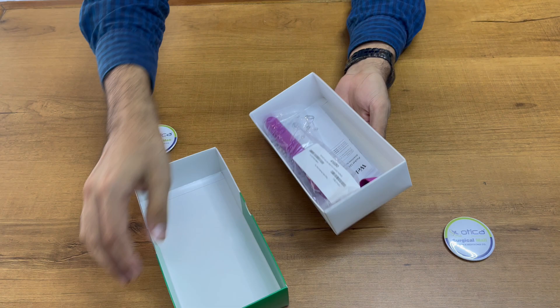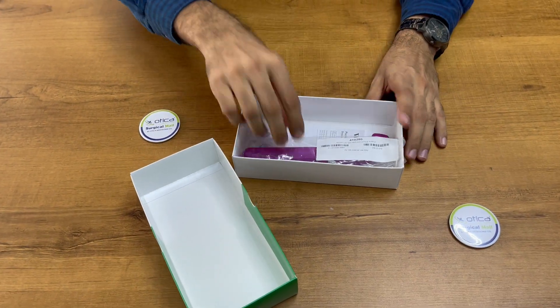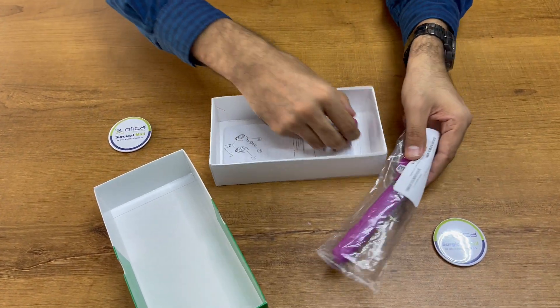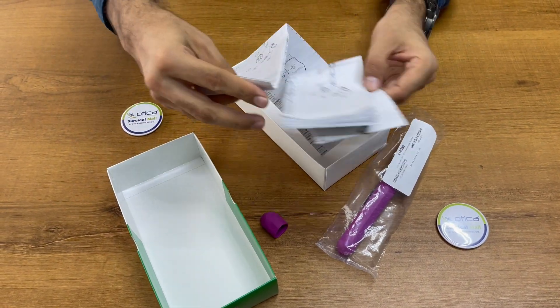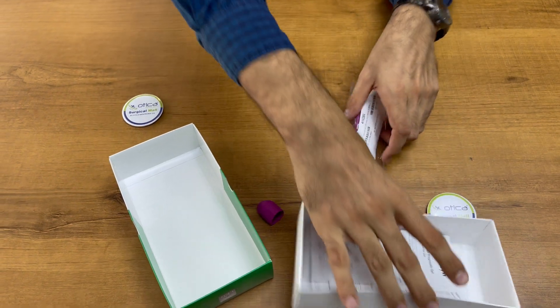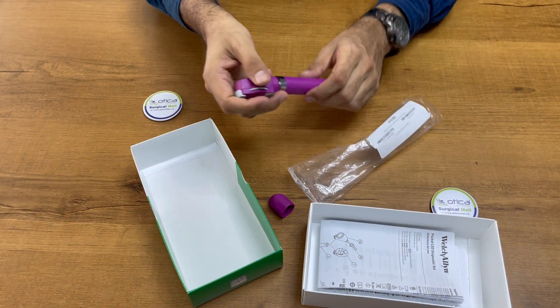You can just open it — this is how we open it. It comes with the main device, a bumper, and a user manual. Two or three types of user manuals are included.